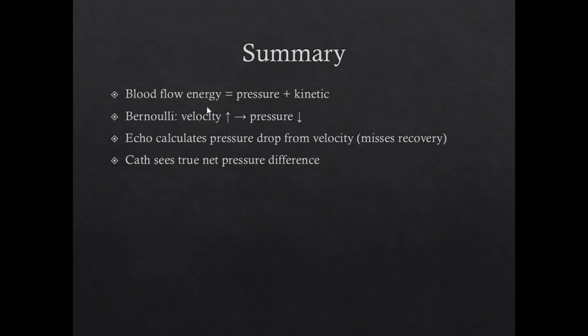In summary, blood flow energy equals pressure plus kinetic, and according to Bernoulli, if velocity increases, the pressure must decrease. Echo calculates pressure drop from velocity, so it does not measure the pressure recovery, and cath sees the true net pressure difference.